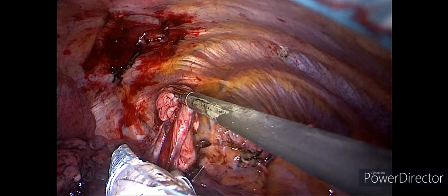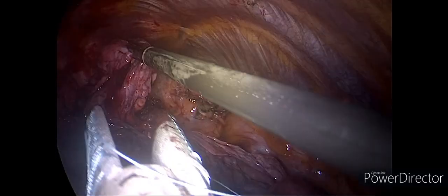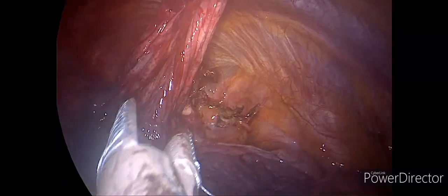Once that's done and the whole upper lobe is now freed from adhesions, we're assessing this bulla. Actually, there were multiple bullae. The largest was seen on the CT, and this was the one. So, using reinforced staplers for very thin wall bullae, we started our transections, taking a very small amount of healthy lung.